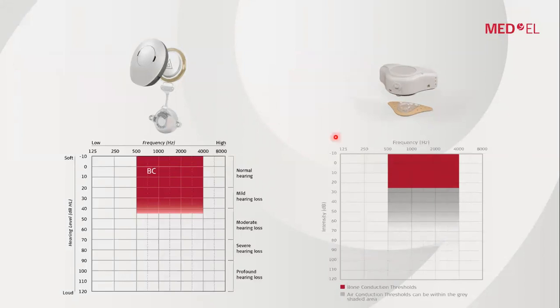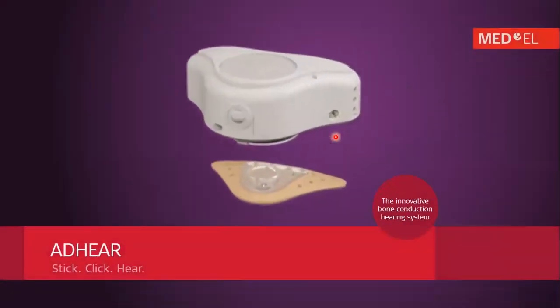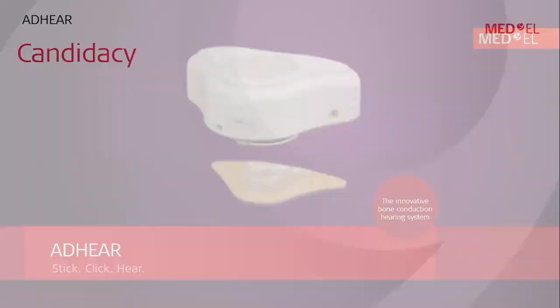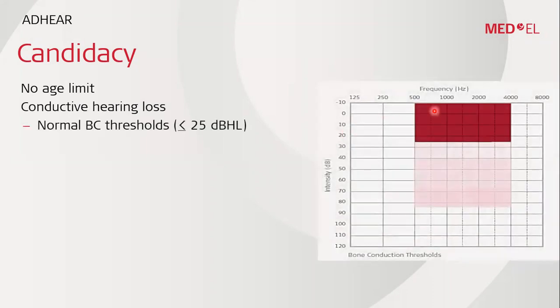So right now, let's talk in much more detail about our only non-surgical solution, which is the ADHEAR. I would like to start with the candidacy. Who are the candidates for the ADHEAR? As already mentioned, there is no age limit, so very young babies can still benefit from the ADHEAR. It's for conductive hearing loss patients, so the bone conduction threshold should be normal, within this shaded area, up to 25 dB. It can be used for unilateral or bilateral conductive hearing loss patients.